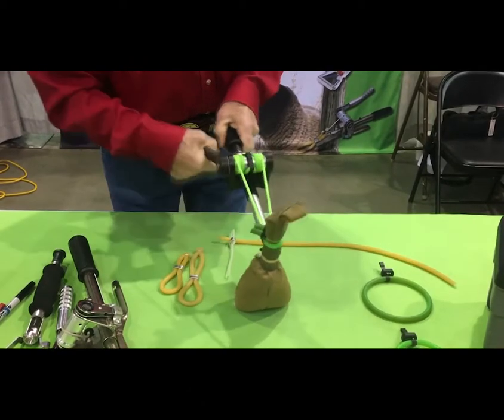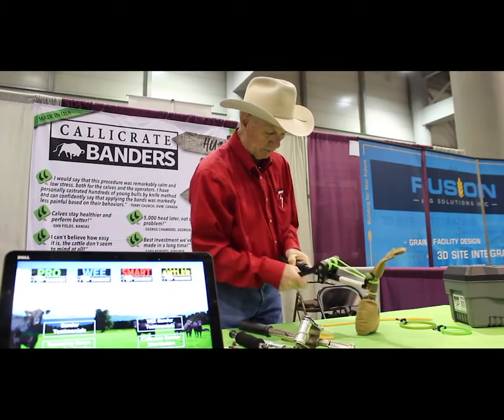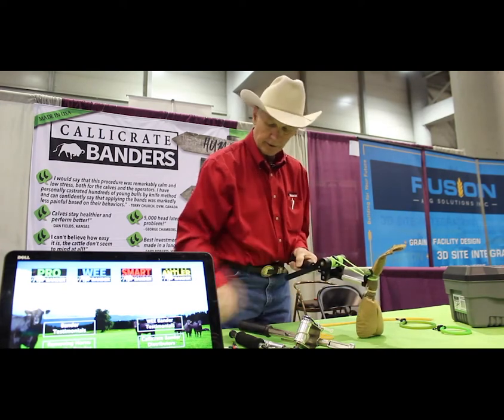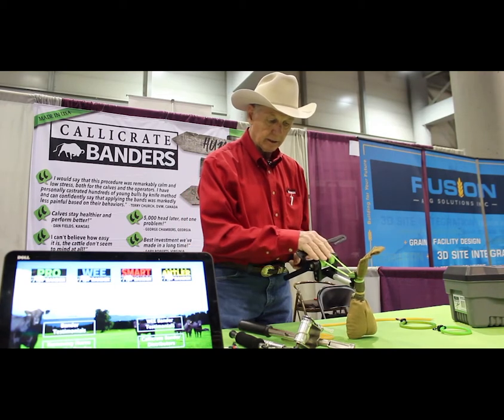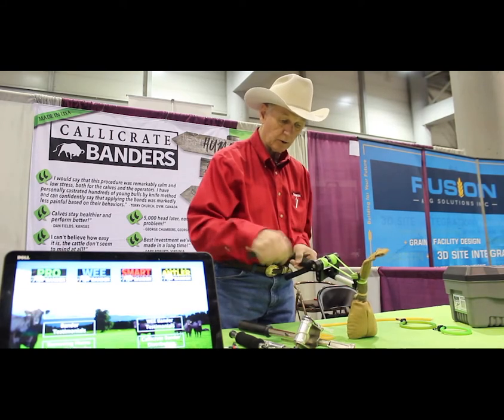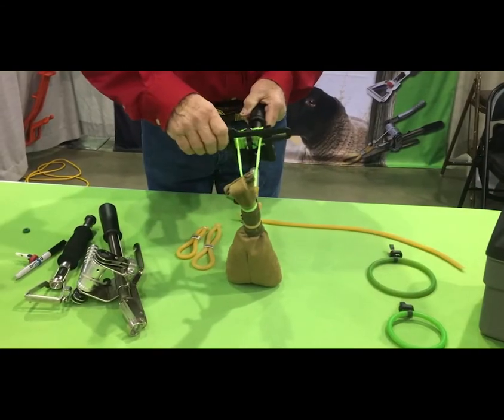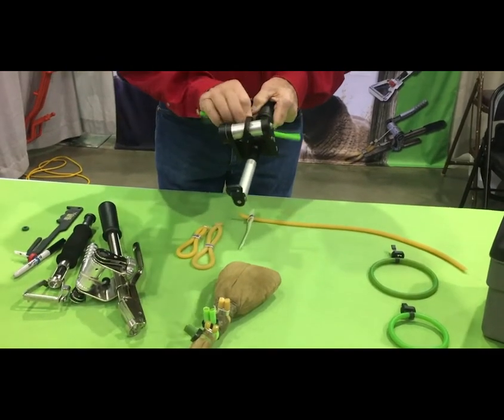As that approaches, we're going to have the same tension as we had with the Smart Bander, and that's about 85 pounds tension. At this point we don't need to crimp it — we'll just use the same cutter and cut it right at the spool. This requires that you absolutely cut it right at the spool and cut them quick, because it takes the energy of this rubber slamming forward to lock that clip good. So we'll just cut them both at once, and that's the use of the Pro Bander.